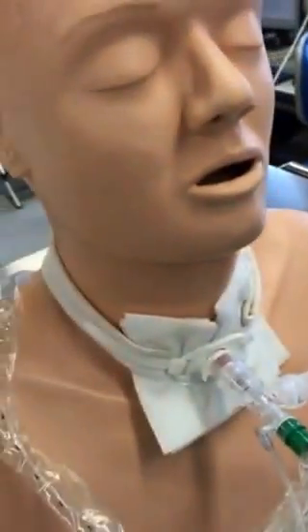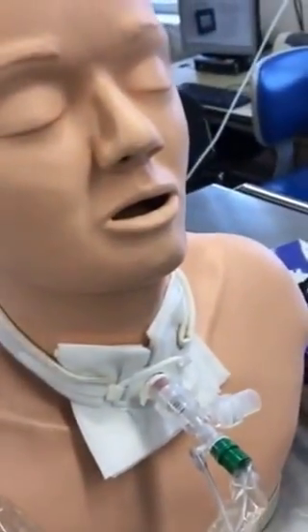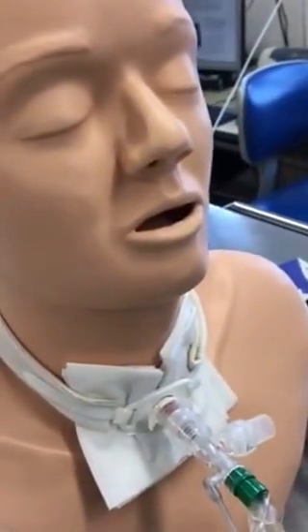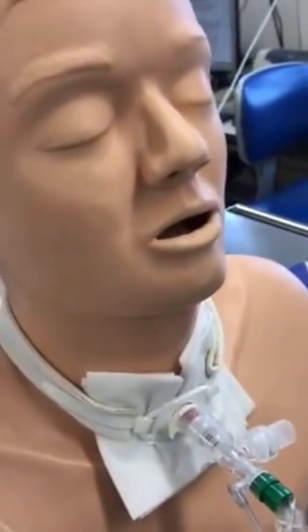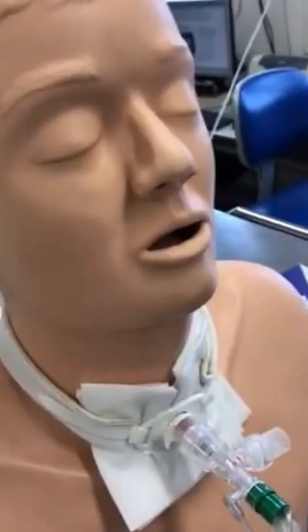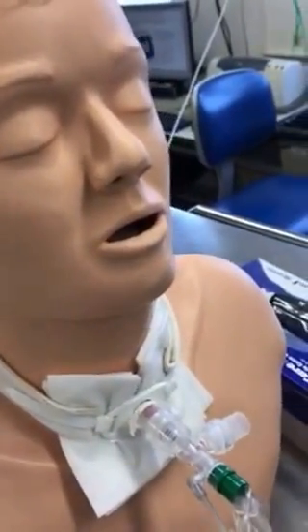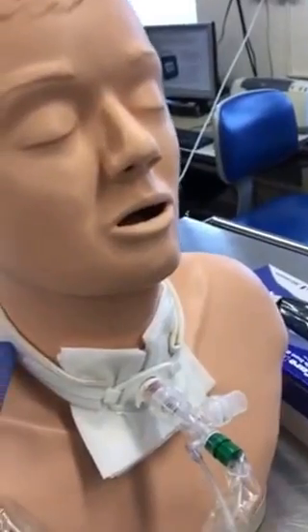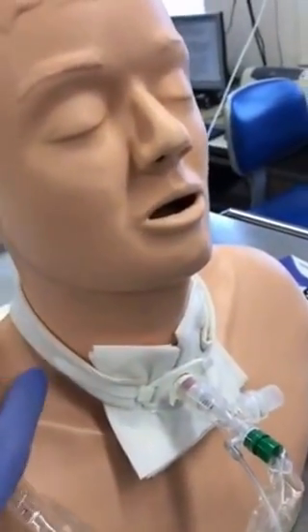Taking a very deep breath, hyperinflating, helps keep the lungs healthy and open. Deep breaths help make coughs stronger, and coughing is one of our body's best defenses against respiratory illnesses. So this MIE, mechanical insufflator exsufflator, helps both with hyperinflation and coughing, which is the best defense against illnesses that could lead to pneumonia.